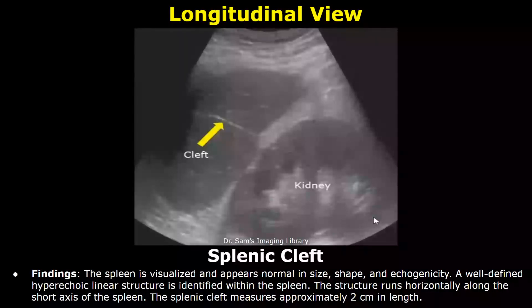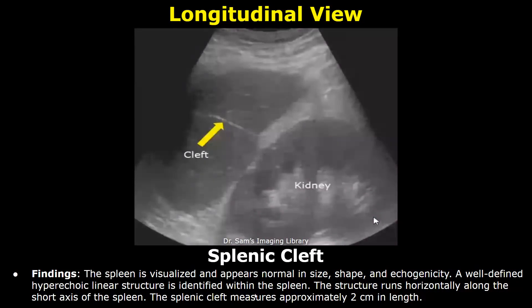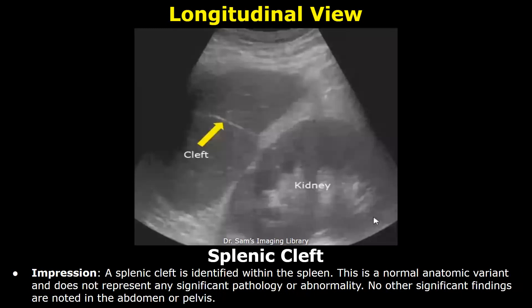In the case of splenic cleft, the spleen is usually normal in size and shape. A well-defined hyperechoic linear structure is identified within the spleen. This structure runs horizontally along the short axis of the spleen, and in the end the size of the splenic cleft is written. In the impression, a splenic cleft is identified within the spleen. This is a normal anatomic variant and does not represent any significant pathology or abnormality.